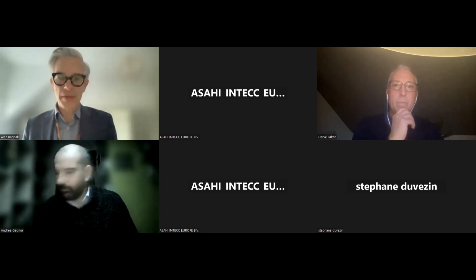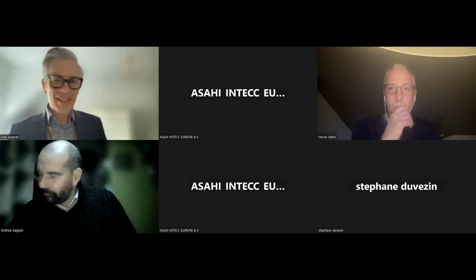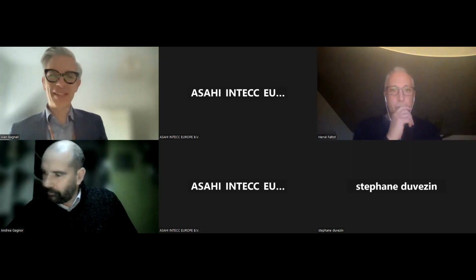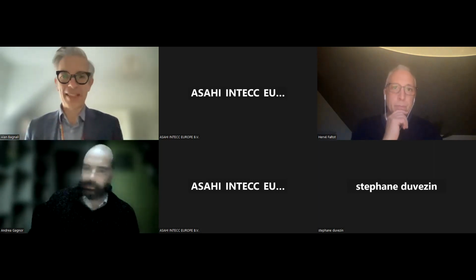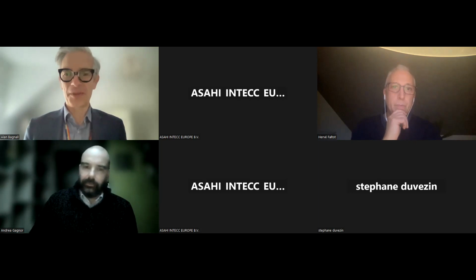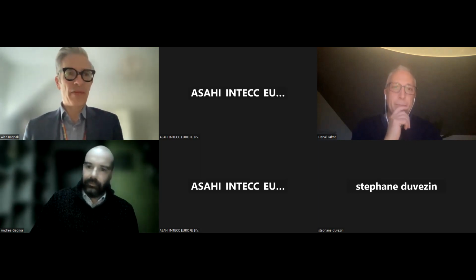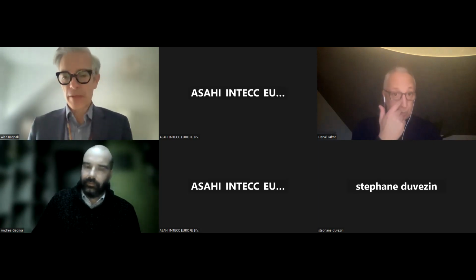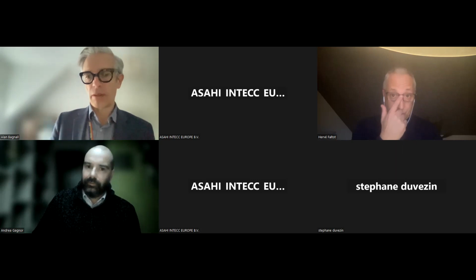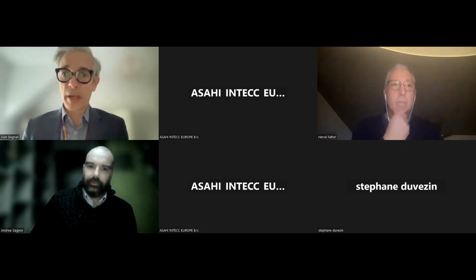Yeah, I think that's one of those interesting situations where, in general, I would say that crossing calcified lesions is a lot easier than crossing CTOs. So it's generally not something I've invested as much time and thought in to try lots of different wires in it. Definitely things that have got polymer jackets on perform a lot better when things get gritty, not surprisingly.